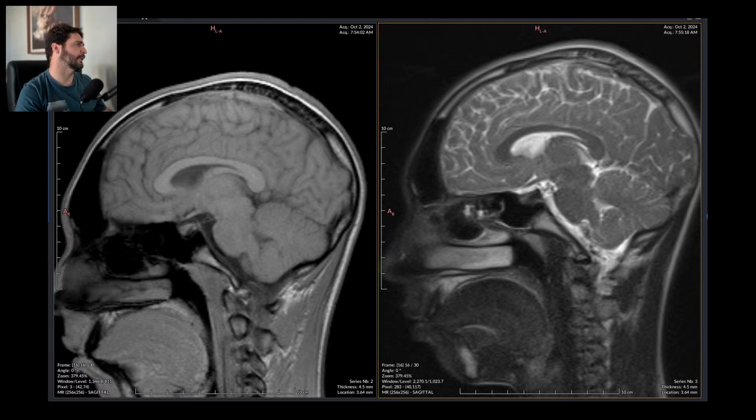Oh, he is 16 years old and he has some kind of epileptic seizure. Thank you, Chris.